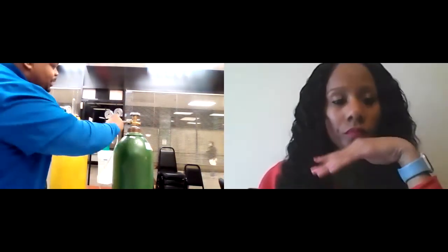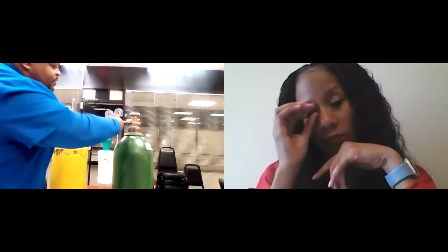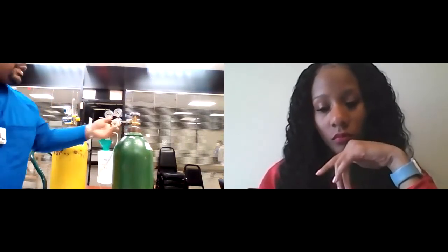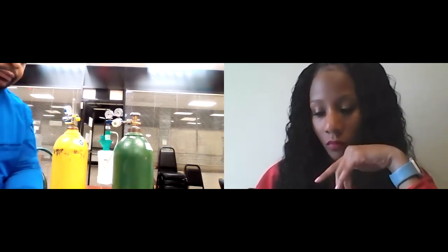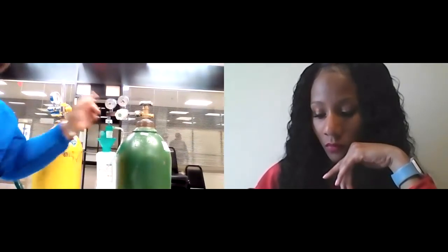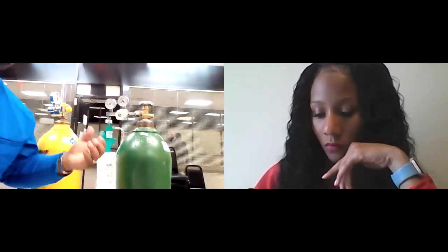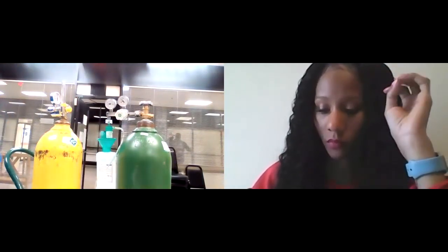So I'm gonna crank this one up to, we're gonna say let's go to 15 liters per minute, okay? I got this one going up to 15 liters per minute. What is the FiO2 coming out of here since there's no Venturi? 100%. So it's 100% coming from this system right here so far. This 100% at 15 liters per minute. So the first FiO2 is 100% and the first flow is 15 liters. Okay. Now, so let me hook up my tubing.